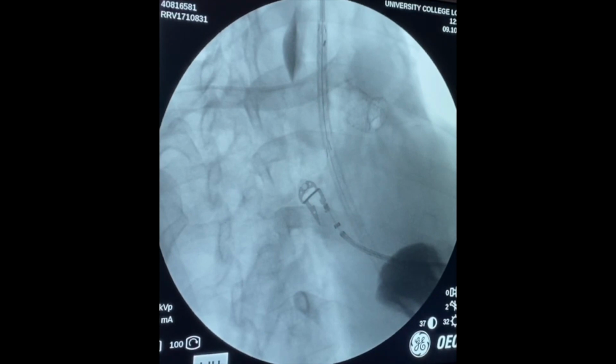It is important to hold the stent with your left hand and release it by pushing forward with your right. And during this process, provide continuous traction and pull back on your stent to avoid it slipping into the stricture. So it's that continuous counter traction as you deploy the stent, and you can see the distal aspect of the stent begin to open up.